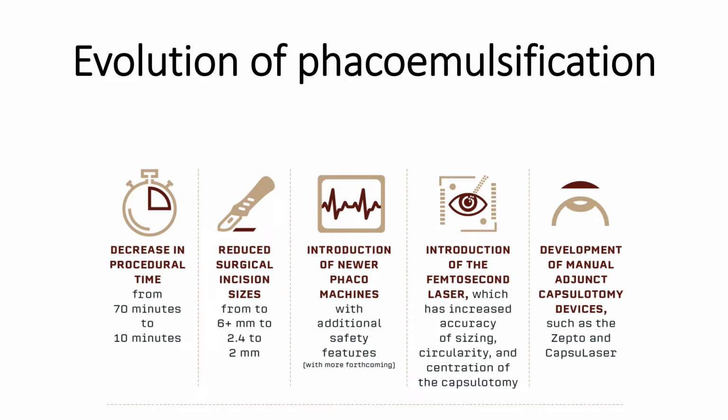And at the same time, those surgeons who have some capital to invest are usually those surgeons who have evolved over a period of time and they are already very good at capsulorhexis, so they may not need these devices. But overall, these are a few milestones which I would like to mention with the progression in the phacoemulsification technique.